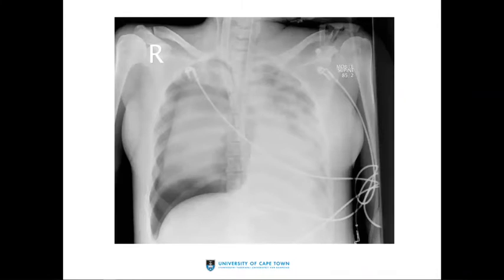And then the other thing to bear in mind is for pleural effusions and for pneumothoraces, if you're not ventilating the patient and there's no hemodynamic problem and you're replacing the lung function with the ECMO, you don't need to put in a chest drain for these patients, okay? And you would rather wait this out. We have been burnt by putting in chest drains and been dealing with bleeding complications while the patients are on heparin, and then you just convert one problem into a massive problem, which is a recurrent hemothorax. So just bear in mind that you don't have to jump to react to an X-ray such as this when you're on ECMO.